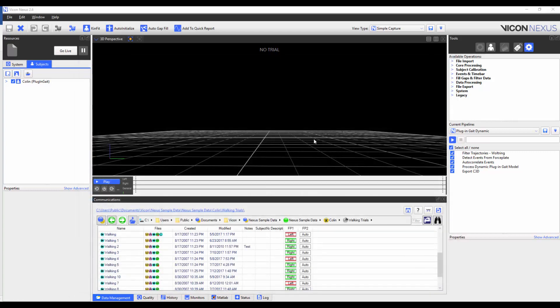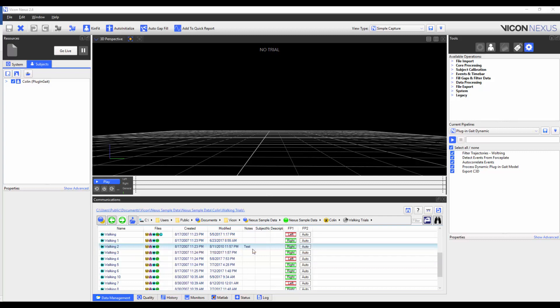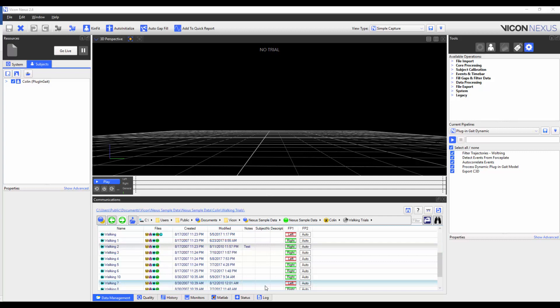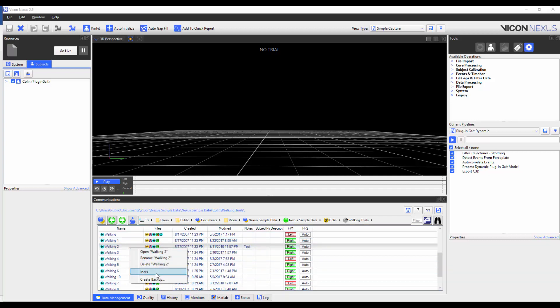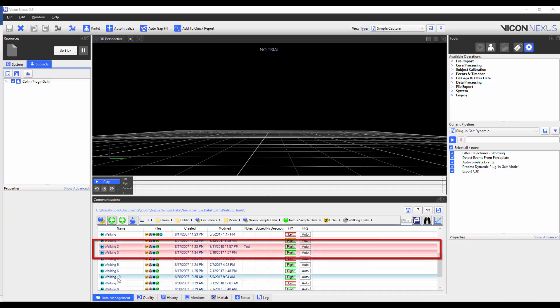It's now easier to identify the trials. When you hover the mouse over a trial, the row is highlighted blue. The trial that is currently selected is grey. And when you mark a node, the row is red.